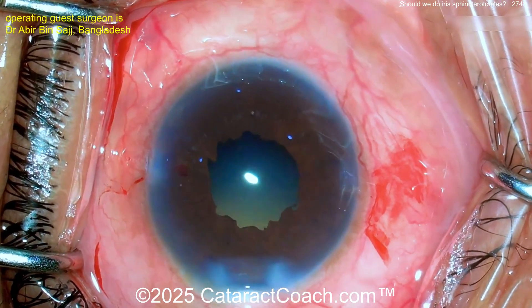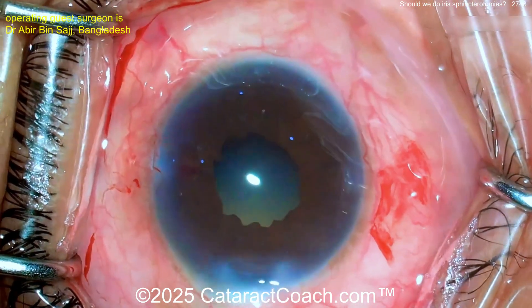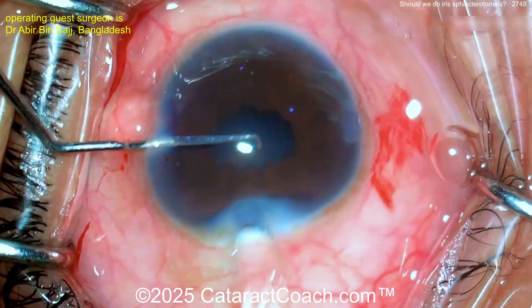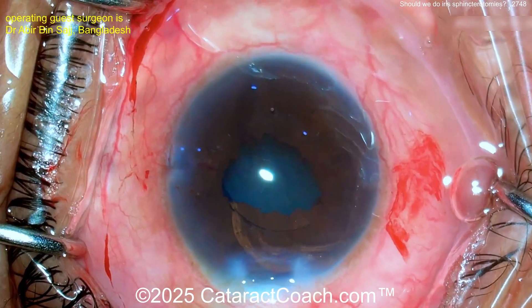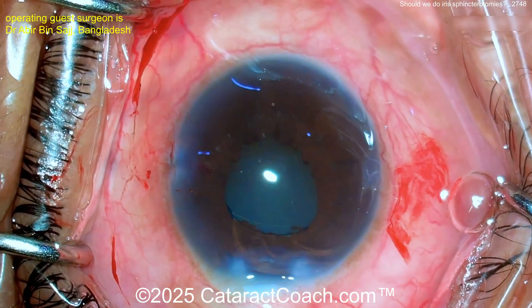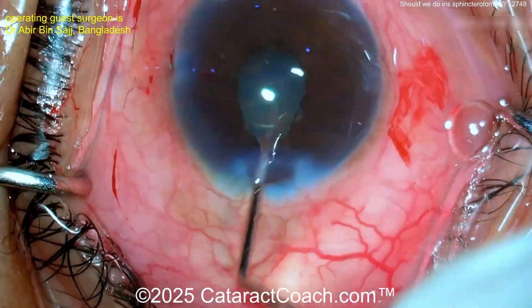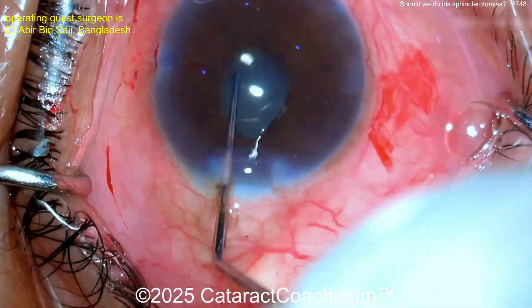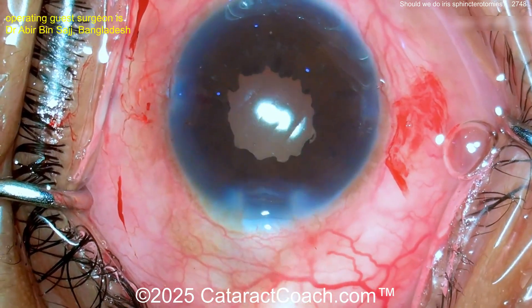There's a little bit of iris prolapse there — that's okay. Put some viscoelastic in. The red reflex isn't the best here — maybe some trypan blue escaped back there, or maybe there's some zonulopathy. Let's get the lens in the bag. You definitely need to make sure this is in the bag properly. The lens is rotating around pretty nicely — oh, there's a good red reflex now; maybe it was just a camera issue.